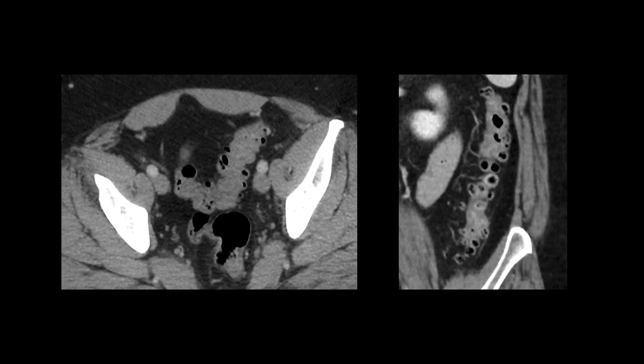These CT images show examples of diverticulosis, which is characterized by the presence of small, round, air-filled or dark outpouchings — which are diverticula — projecting from the colon wall.